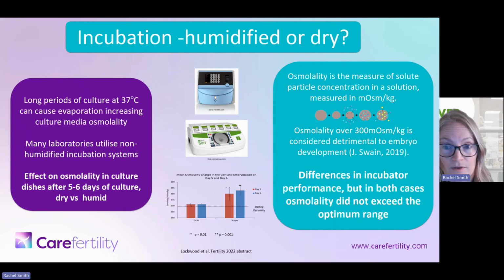Well, Megan Lockwood, who is one of our lovely embryologists at Care, did look at this and presented her findings at Fertility 2022 on the difference in the change in osmolality over days when you're looking at a humidified system like the Geri versus a non-humidified or a dry system like the EmbryoScope. All the dishes were produced with the same media, with the same starting osmolality of 270. We prepared the dishes in the same way, and then we cultured them in these different incubators at the same time to assess the evaporation. So they had the same exposure of environmental conditions.